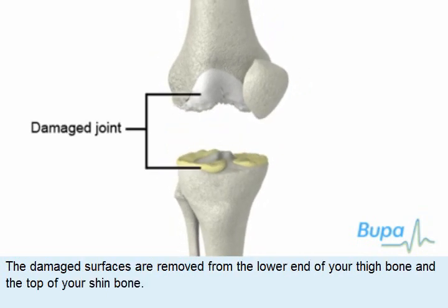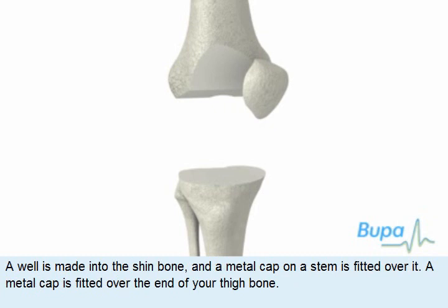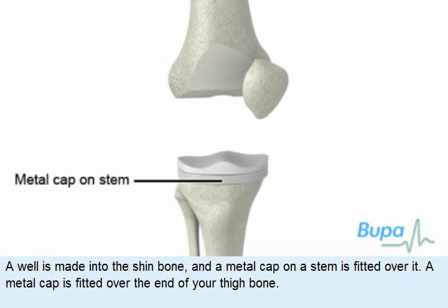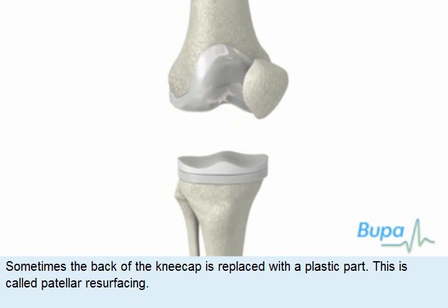The damaged surfaces are removed from the lower end of your thigh bone and the top of your shin bone. A well is made into the shin bone and a metal cap on a stem is fitted over it. A metal cap is fitted over the end of your thigh bone. Sometimes the back of the knee cap is replaced with a plastic part. This is called patellar resurfacing.